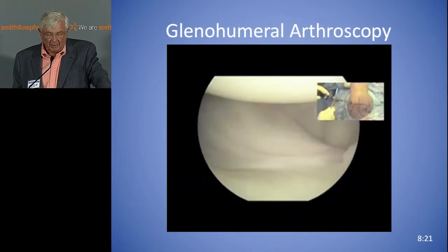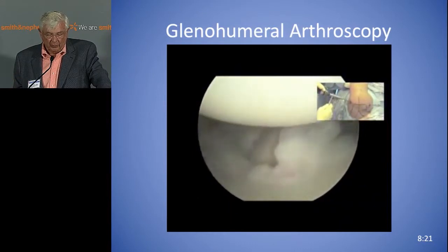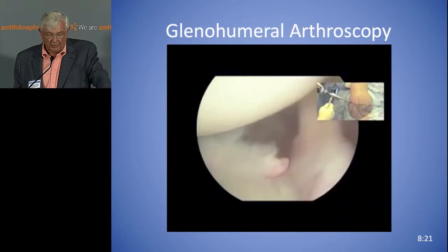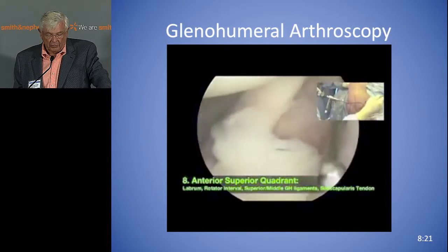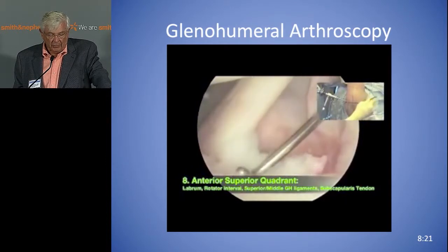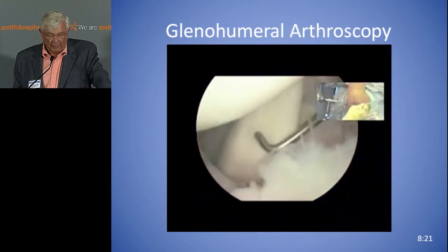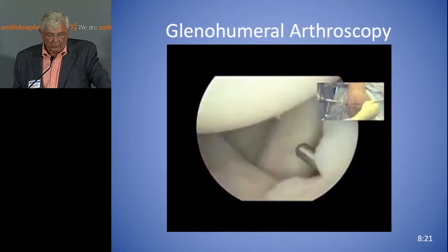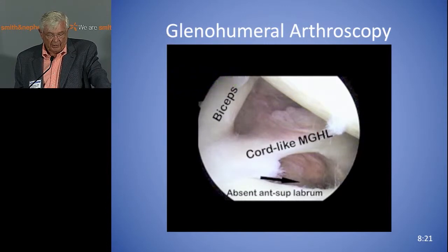This way you don't miss anything when you're doing your study. I actually have a graphic sheet that I use in surgery to record how these various structures look. So now we're coming back to the anterior superior quadrant. There's a lot of variation in this anterior superior quadrant — this is where the variations occur in the shoulder. There's the subscap. He had to name this the Buford complex — actually, Dr. Donny Buford was a medical student watching him. So that's how these great names start.